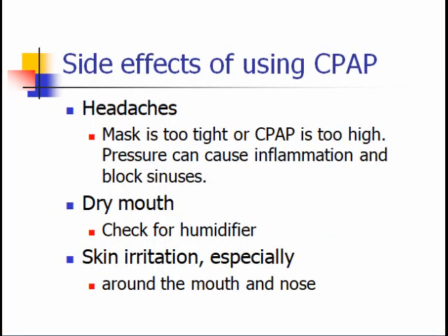The additional side effects of using CPAP can be headaches. Sometimes that's caused by the mask being put on too tight, or the CPAP pressure is too high. That pressure can cause irritation, inflammation, and block your sinuses. If you wake up and you have dry mouth, check to see if the humidifier is working and has water in it.